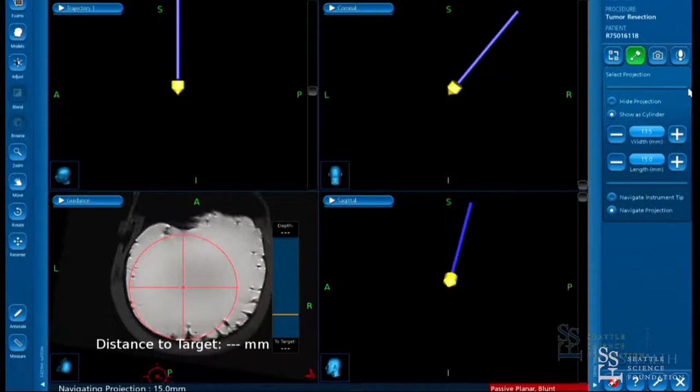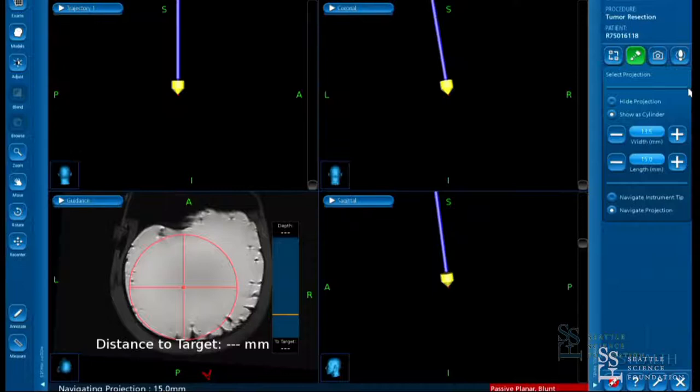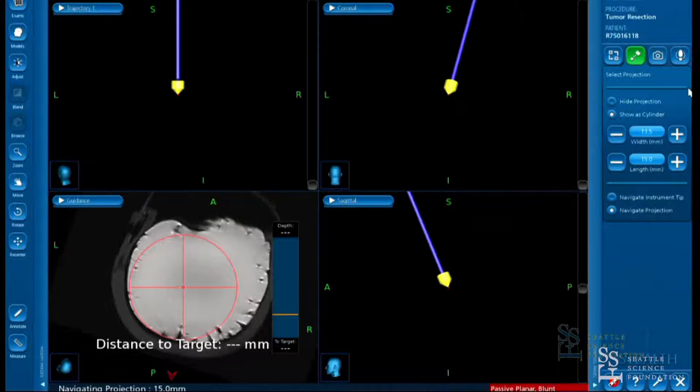Depending on what your target is, you're either going to target deep and work your way out, or target superficial and work your way in. When you're first starting, a general rule of thumb is to shallow dock for tumors and dock deep within a hematoma.